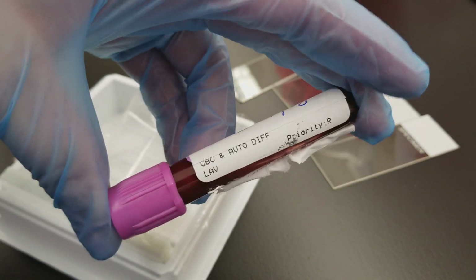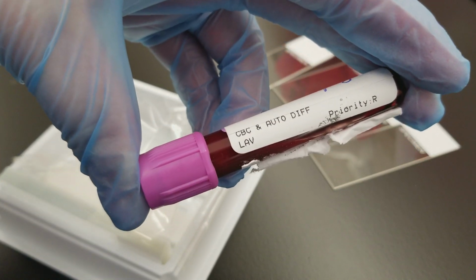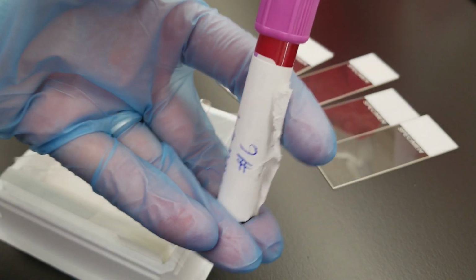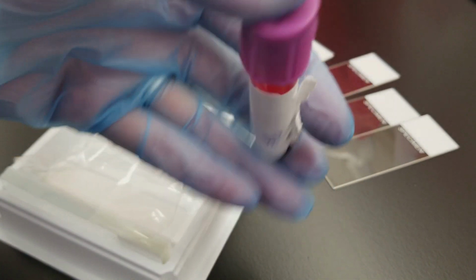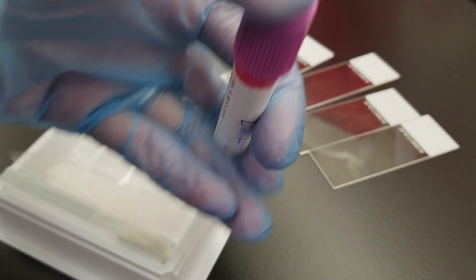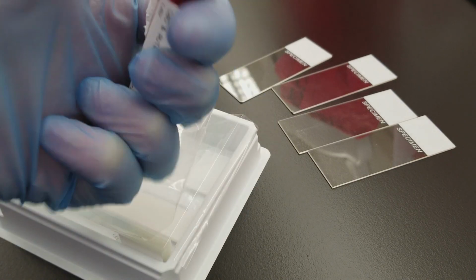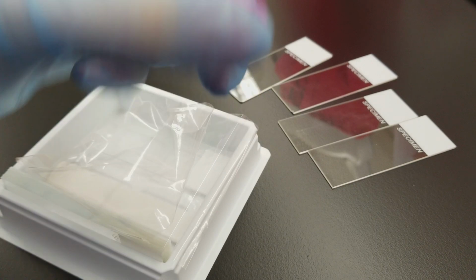As you can see, this was ordered for a CBC with an automated DIF. That would be performed on an automated analyzer, and only when a flag or results warrant a smear review, then we would actually do a smear review or a manual WBC differential or something to that effect, a platelet estimate. All of that would only be done if the automated CBC results indicate that need.